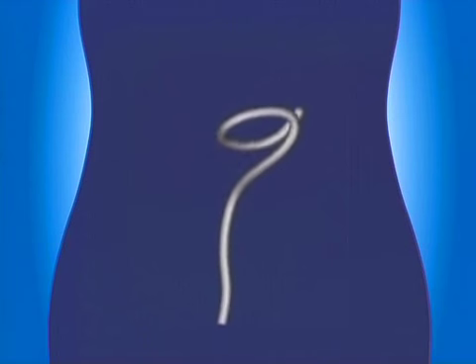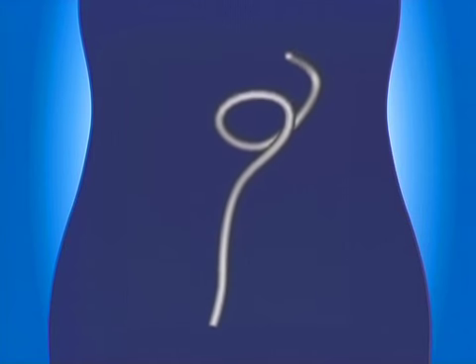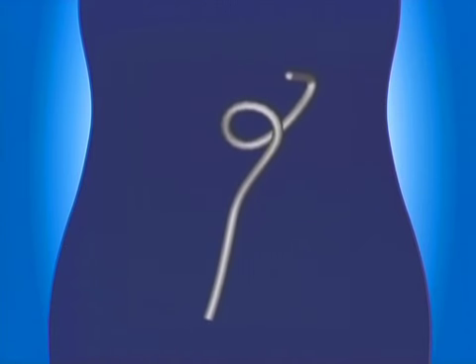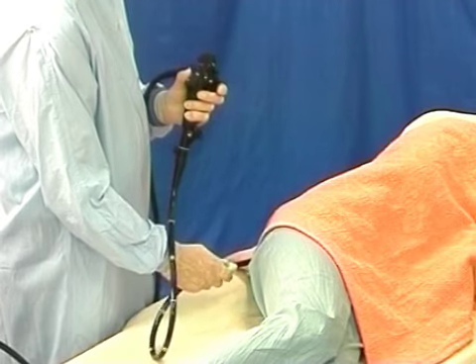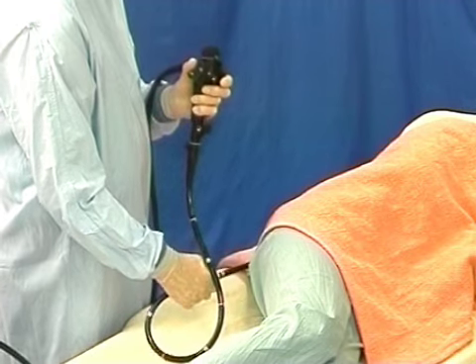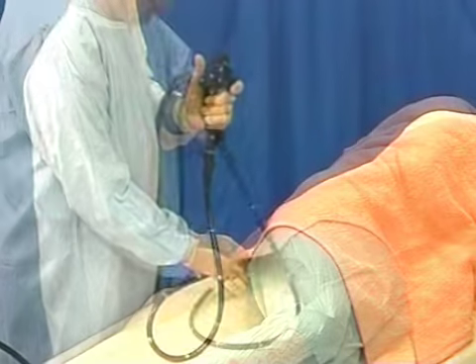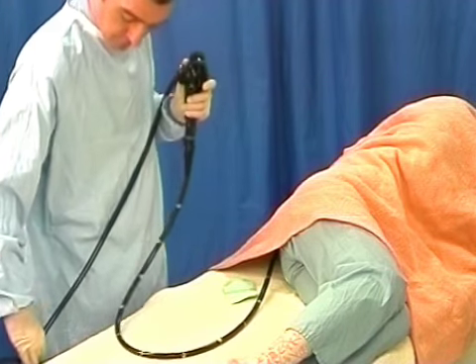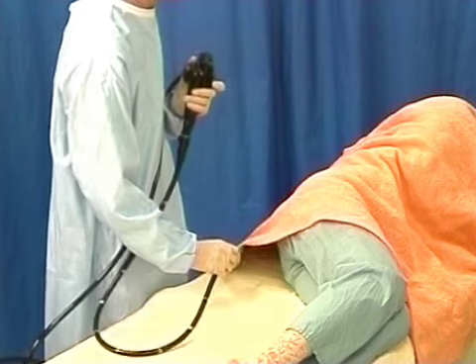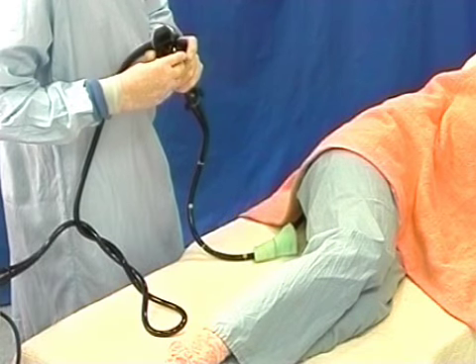An exaggerated example of an atypical loop, when the descending colon is very mobile on a persistent mesocolon, is a reversed alpha loop. This is an anti-clockwise spiral which can only be straightened out by torquing anti-clockwise while pulling back. Rotating and derotating the shaft often results in loops outside the patient, which makes shaft handling awkward. Straighten out the shaft by derotating the control body, so the loops are transferred from the shaft, where they matter, to the umbilical, where they don't. There may be up to 3 loops in the umbilical before it needs to be disconnected from the light source and straightened.